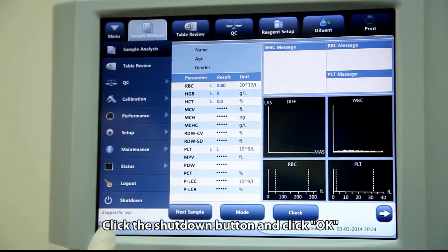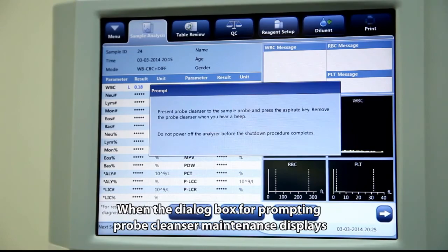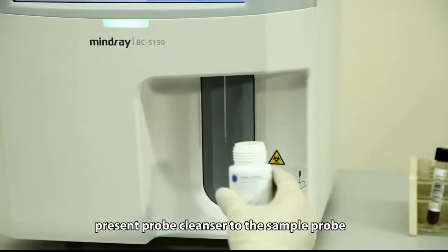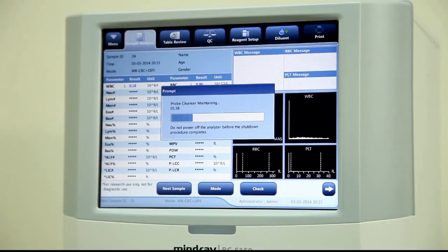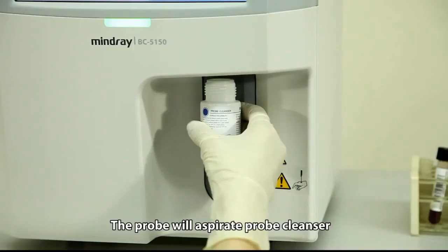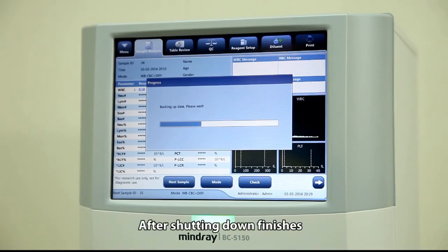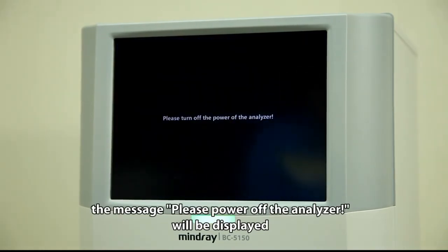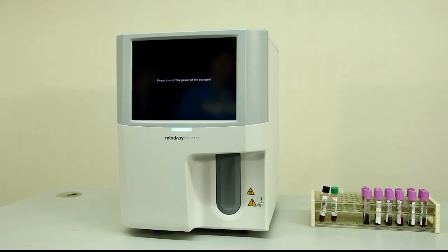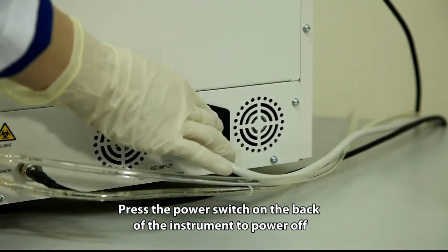Click the shutdown button and click OK when the dialog box for probe cleanser maintenance appears. Present probe cleanser to the sample probe and press the aspirate key. The probe will aspirate the probe cleanser and the BC5150 will clean the whole system automatically. After shutdown is complete, the message 'Please power off the analyzer' will be displayed. Press the power off switch on the back of the instrument to power off.